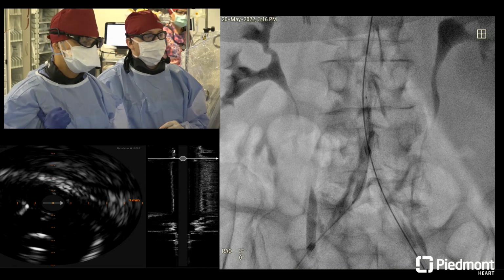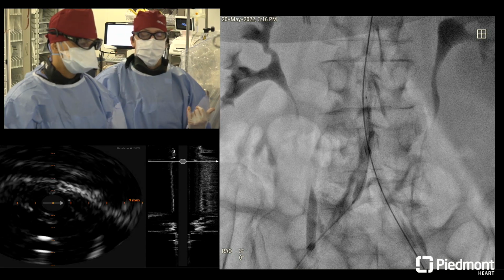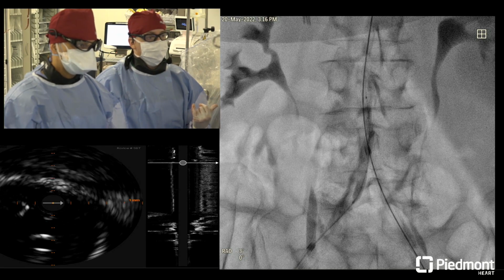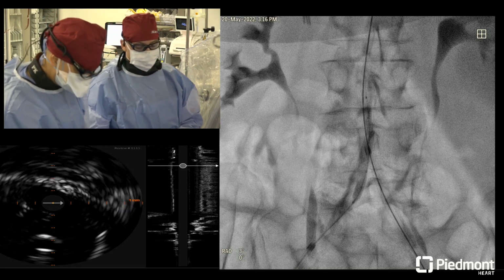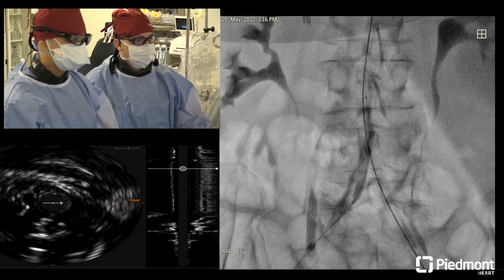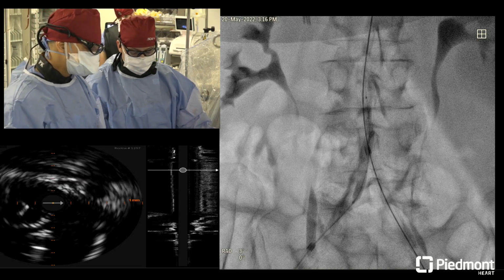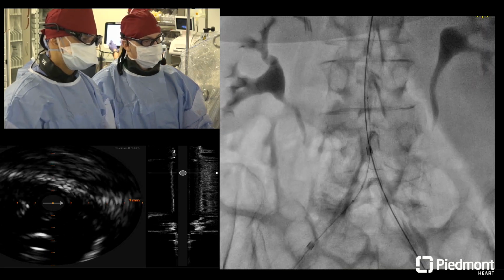6.0 size. So you guys, I think the nice part is it's the fast. It's so much nicer using the M5 plus. It's 2 per second, and life is so much faster now when using that. The other day I had to use 2 of them. I went from M5 plus down to the regular 5, and it was quite boring for the next 3 minutes. And Drew, you're in the subintimal space here, is that correct?